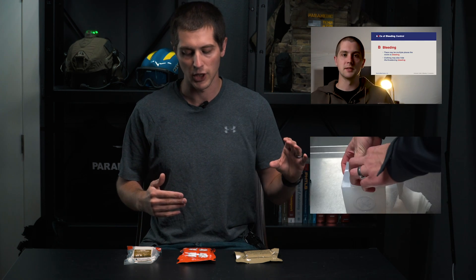Wound packing is a critical intervention for somebody that's bleeding heavily from a junctional site — we're talking about the base of the neck, the armpit, and then the groin. Basically places where you cannot place a tourniquet. If you're interested in learning more about wound packing specifically or Stop the Bleed, I do have two videos going over both those topics in depth that you can check out.